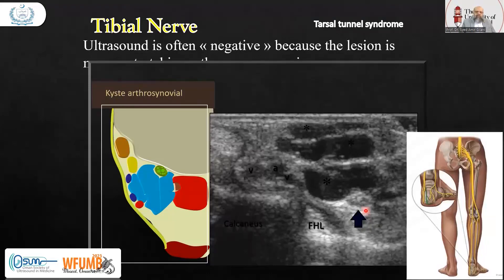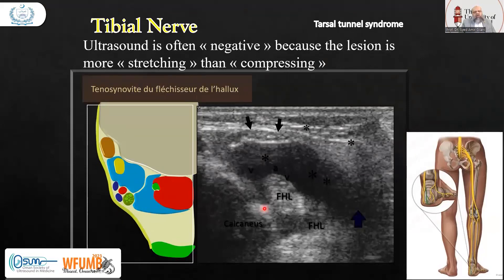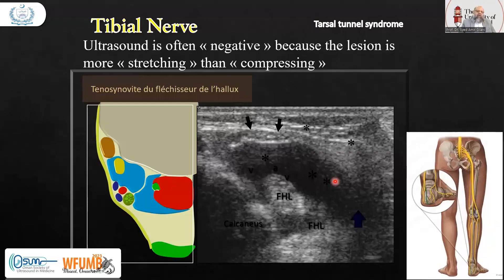Then comes the tibial nerve. Here you can see the flexor hallucis longus. Ultrasound is often less informative because the lesions in this area are more stretch-related than compression-related. Instead of compression, there will be stretching of the nerve, which is why the compression signs and inflammation will not be as easily diagnosed on ultrasound in this area.